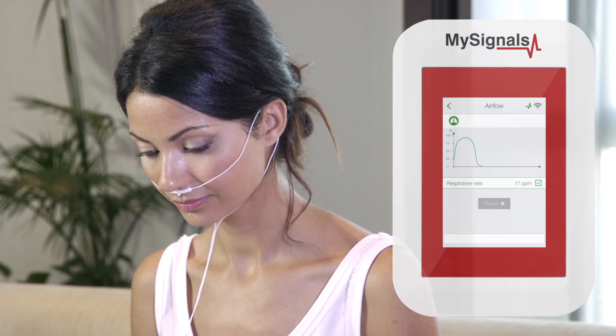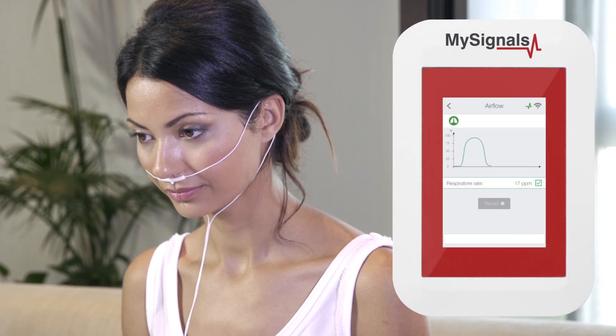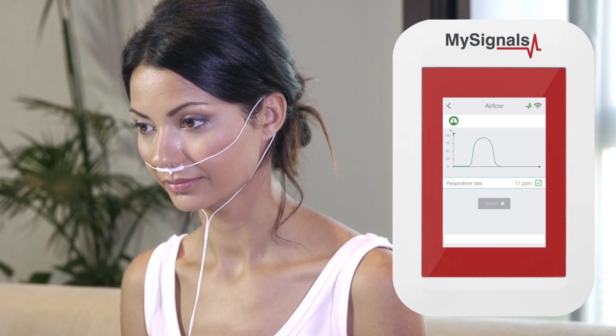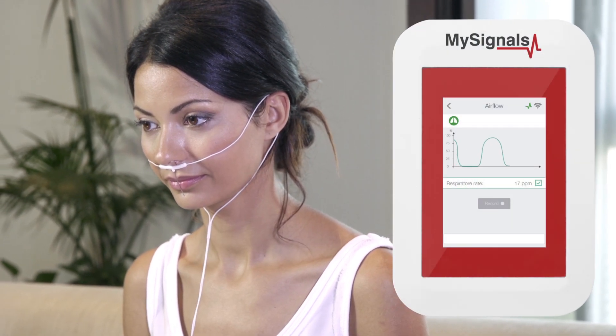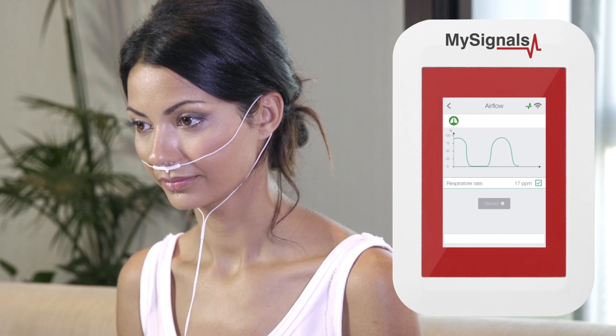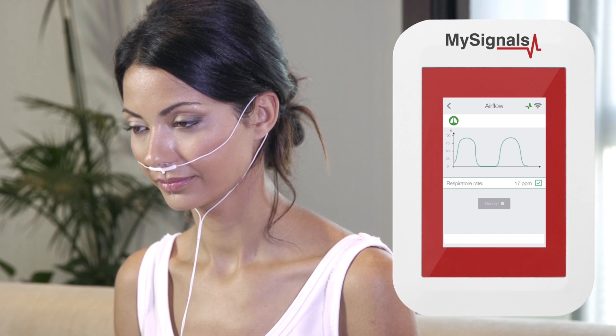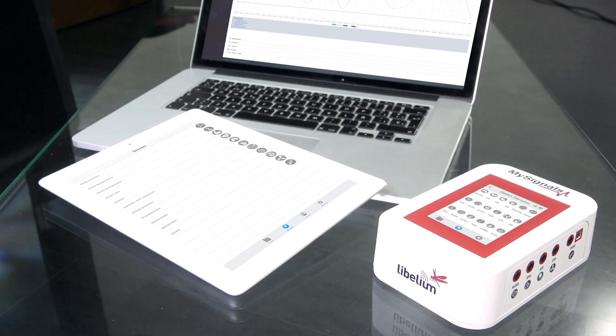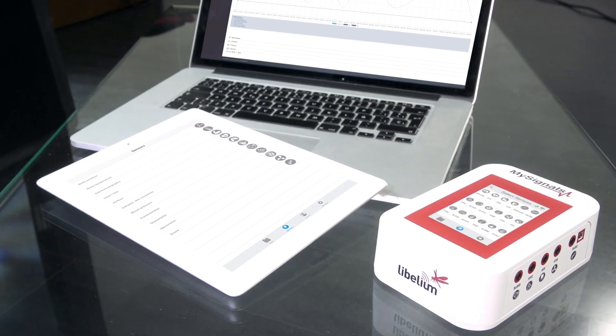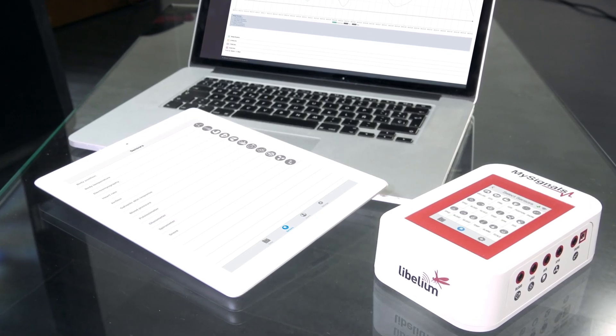Now you can visualize Airflow values in real-time on the MySignals screen using the Standalone mode. Remember you can also send the data to the cloud by using the Bluetooth and Wi-Fi modes.